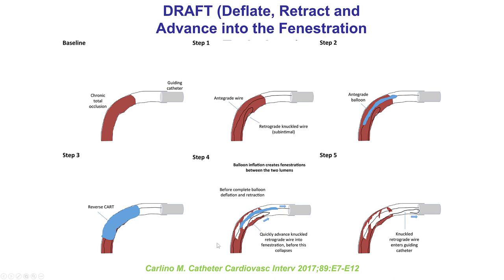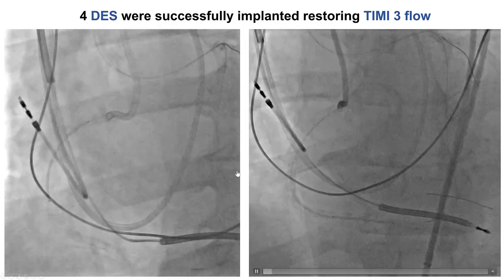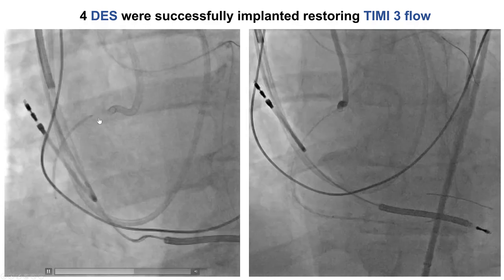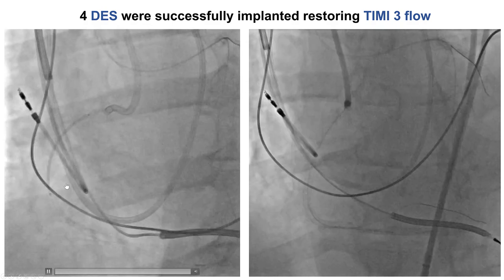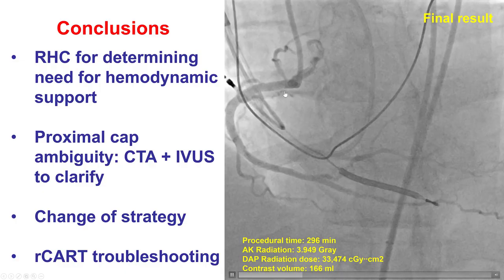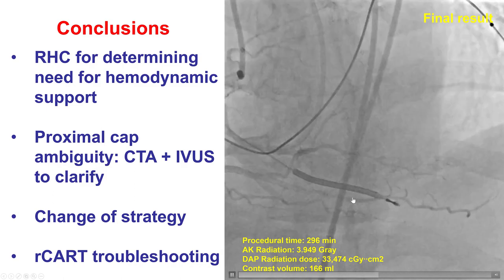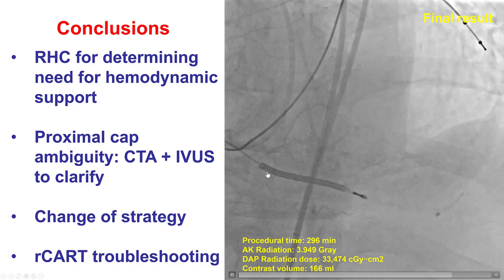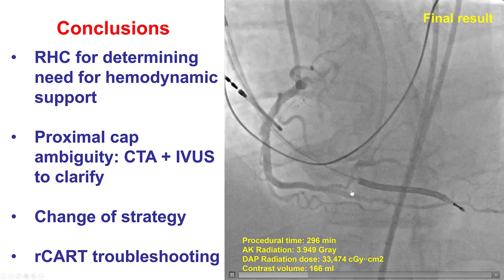This technique is by Dr. Carlino and requires two operators: one inflating then pulling back the balloon, while the second pushes the retrograde guide wire tracking the course of the deflated antegrade balloon. After crossing, the guide wire was externalized, followed by implantation of four drug-eluting stents, providing a nice result with TIMI 3 flow into the right coronary artery. The patient remained hemodynamically stable throughout the procedure.